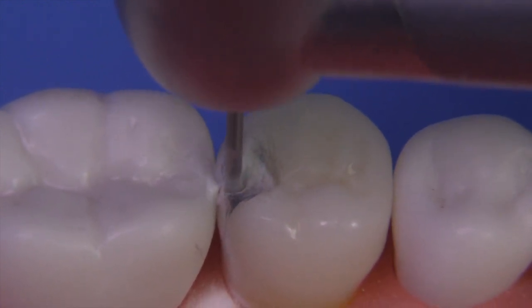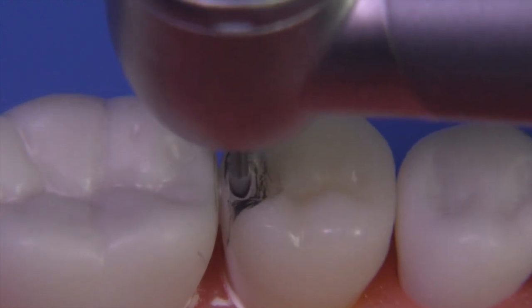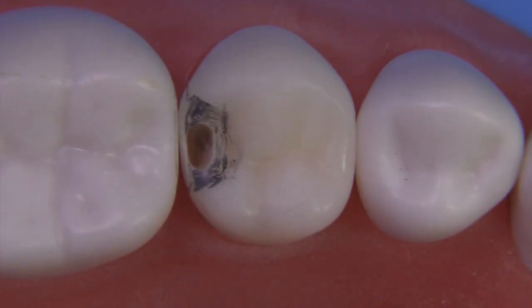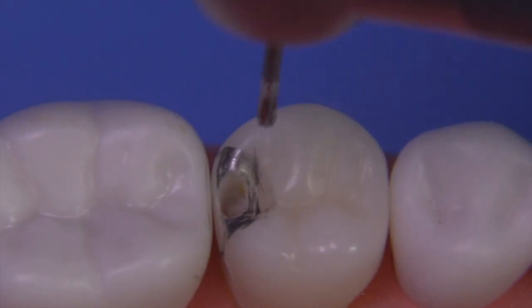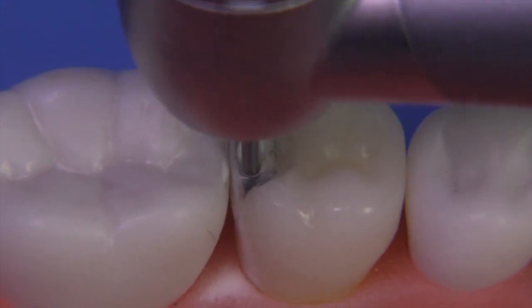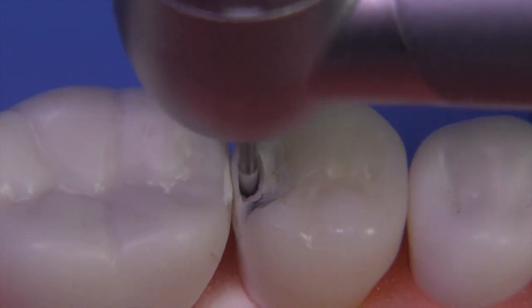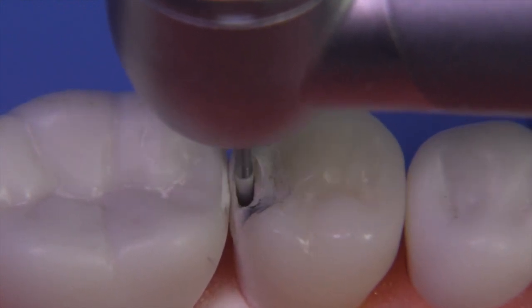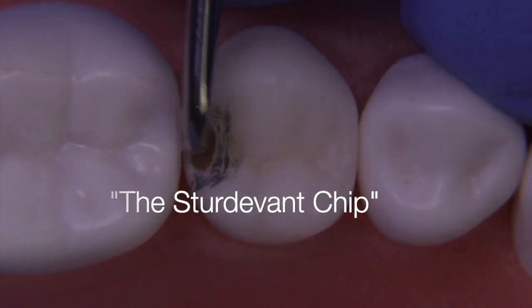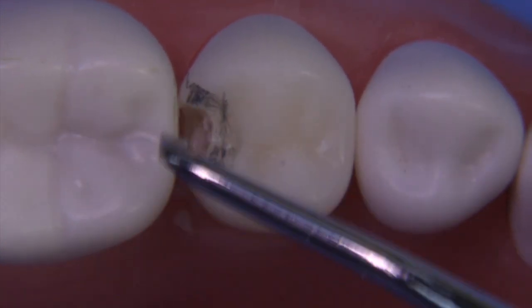Basically you're just swinging the bur buccal-lingually, keeping in mind that the buccal wall is going to lean towards the lingual slightly, while the lingual wall will be straight up and down and follow the long axis of the tooth. We'll continue until we can remove that little shell on the distal. It's always nice to cut a little bit, blow it out, then look again and continue repeating the cycle. During the Sturdivant chip, just knocking the wall off like we've done in the past, leaving little beaks of undermined enamel on either side which we chop off at a 90-degree exit angle.